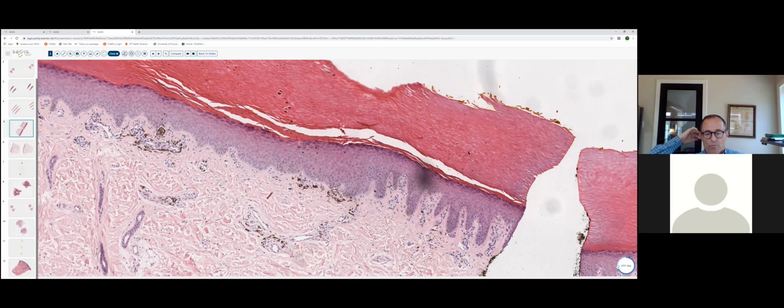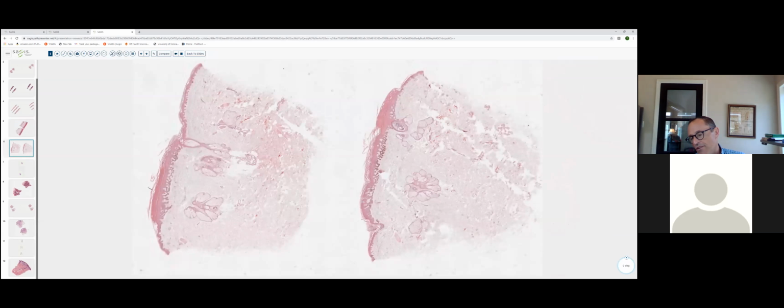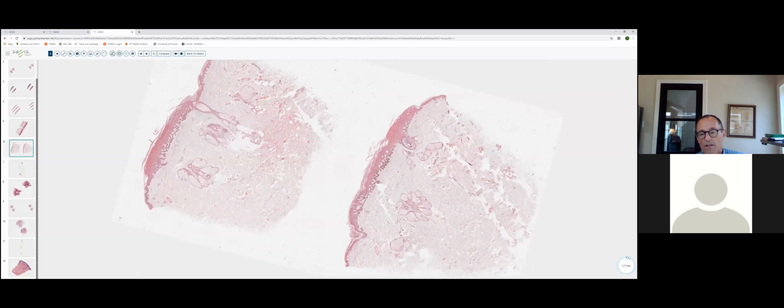And occasionally we jokingly say that a lesion looks like a "gentigo." So it's largely solitary melanocytes, but maybe you begin to see two melanocytes kind of grouping together and three kind of make a nest. So there is a transition that occurs in a lot of instances from simple lentigo, which is a melanocytic proliferation, to junctional nevus. Now, this is in contrast to the next case, case 6.